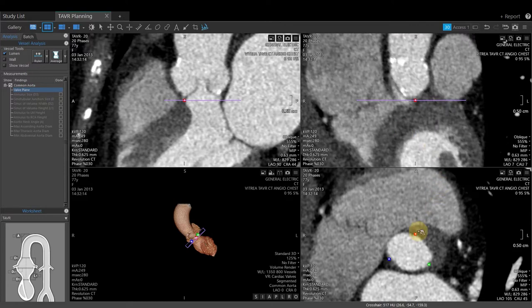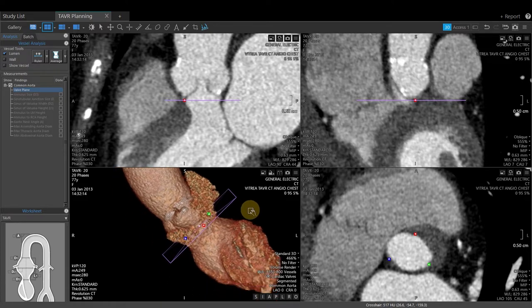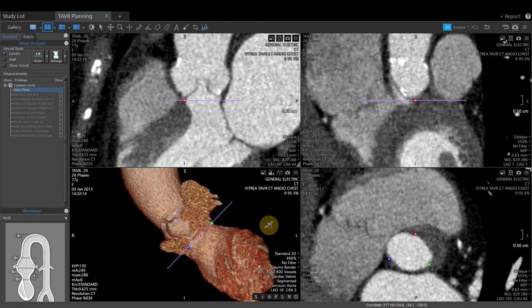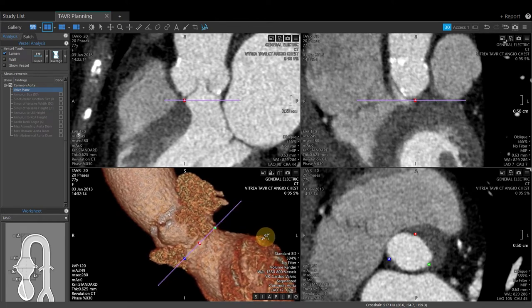Now that we are happy with the valve plane, a common measurement to create is the C-Arm angle, created in the 3D view. Roll the center wheel on the 3D to zoom in, and hold down the center wheel to pan. Note the red rectangle for the right coronary cusp and the white box at the midpoint of all three points. Right-click and rotate the 3D so the red box is on top of the white box and a single purple line is displayed. The C-Arm angle approximation is shown at the bottom right-hand corner — LAO 17, cranial 2 for this exam.